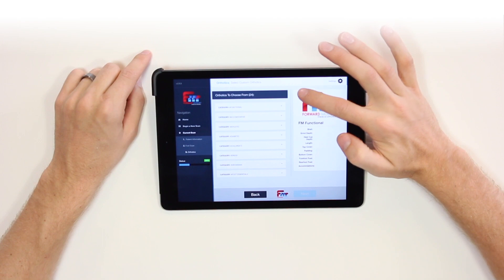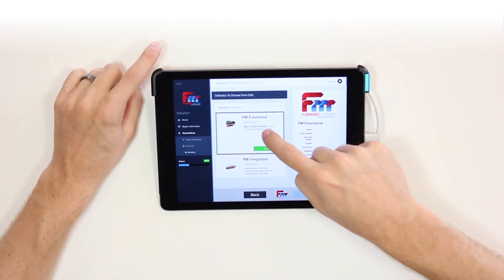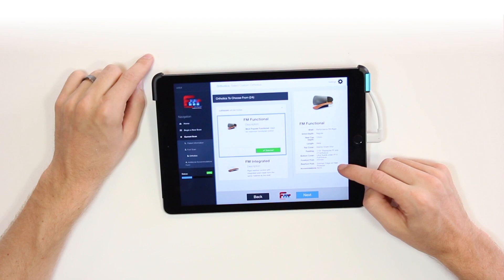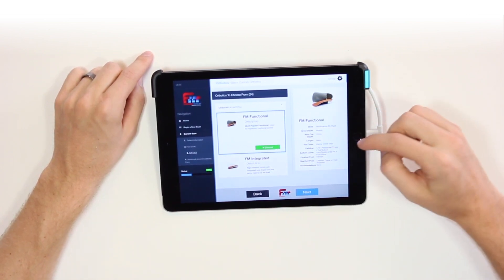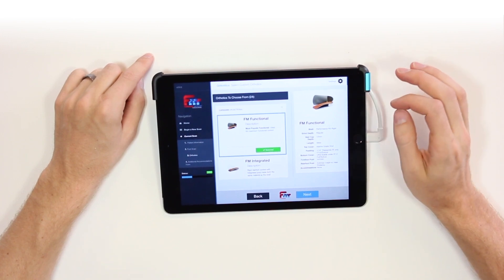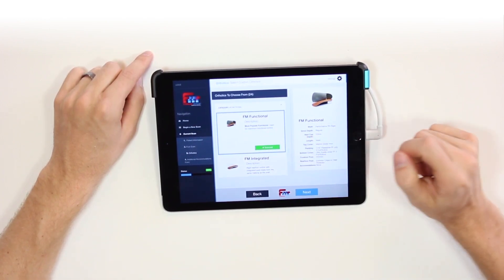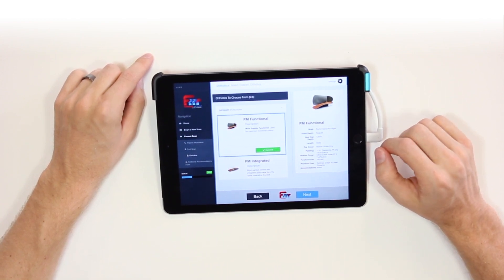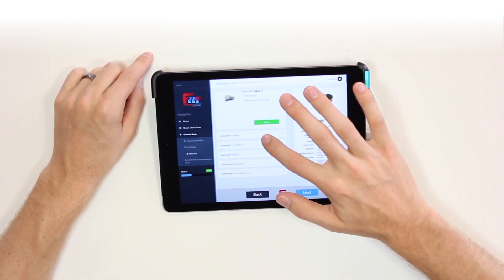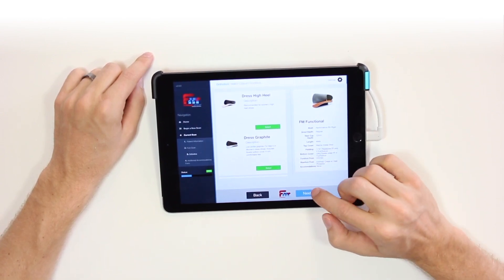Here on our catalog you can see a list of all the devices we have — they're all lab standard devices. If I click the functional category and select the FM Functional, it gives me a device with lab standards and a brief description of what it's best used for. For example, it's a rigid shell with a 12mm heel cup and an extrinsic heel post made of crepe. The FM Functional is one of our most popular devices. You can also scroll down to see other categories such as athletic and diabetic dress. To move to the next screen, you must select one. When you're ready, push the next button.